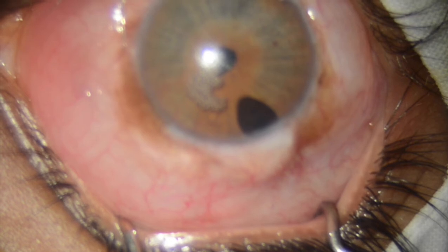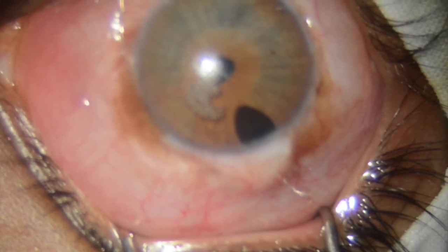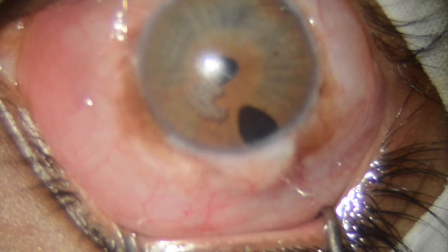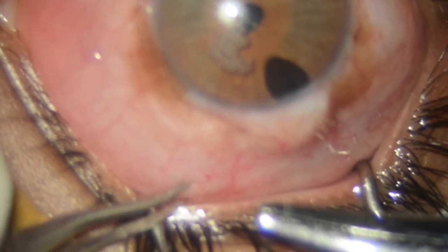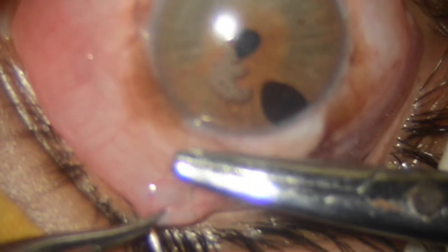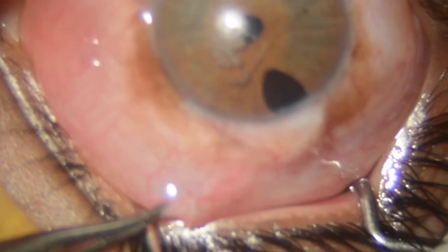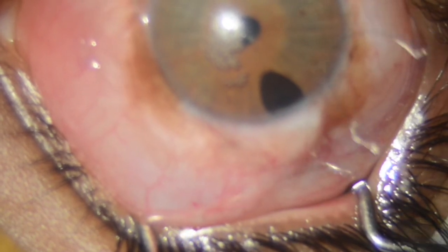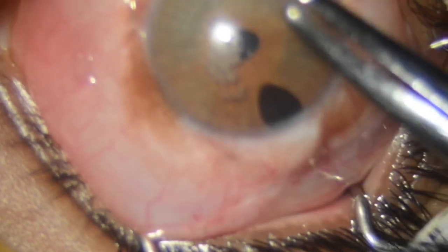In this way, we have bypassed the troubled tissues of the perilimbus and created a useful filtration track. Before the next step, I close the 200-micron track with a suture to prevent excessive flow from the bleb, which is also important.